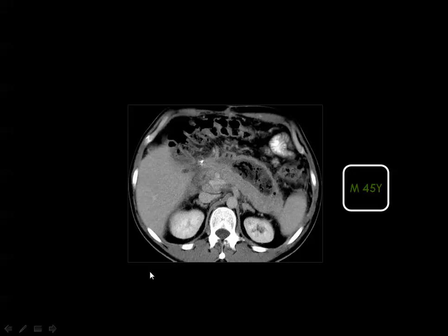As I have mentioned in the lecture of pancreatic imaging, after pancreatitis you get fluid collection in the region of the pancreas, which is known as the pseudopancreatic cyst. And this pseudopancreatic cyst may be secondarily infected, resulting in pancreatic abscess. I have said that in order to differentiate between the pseudocyst and the abscess, there should be some air inside the collection to predict the nature of being an abscess.